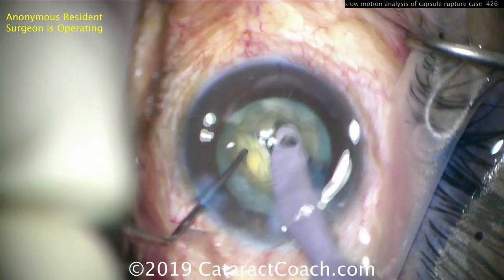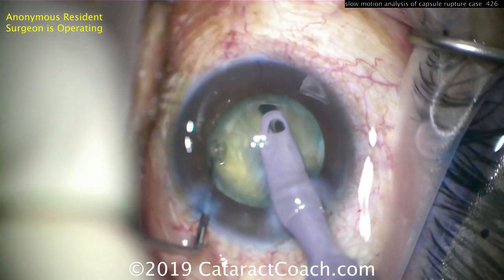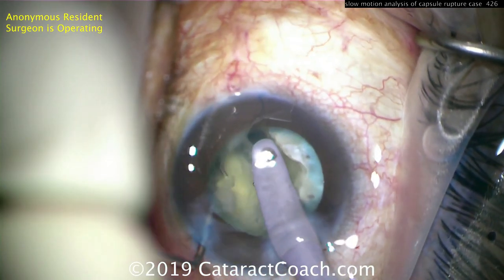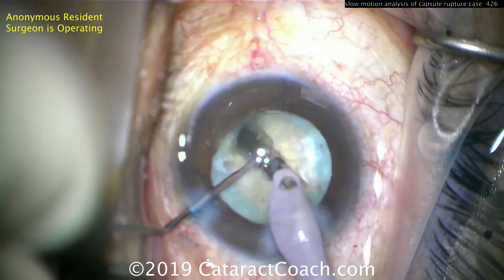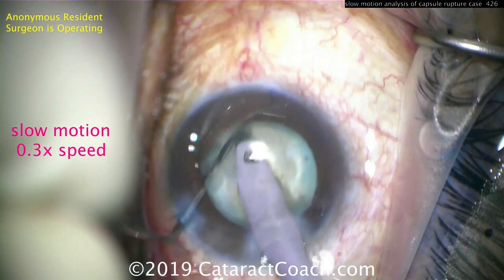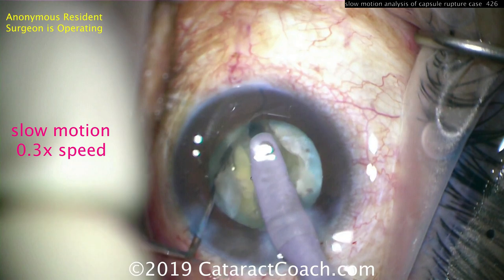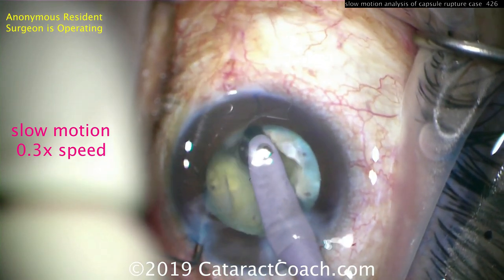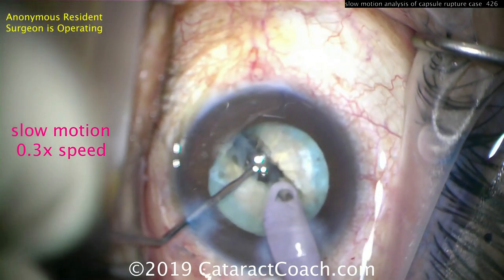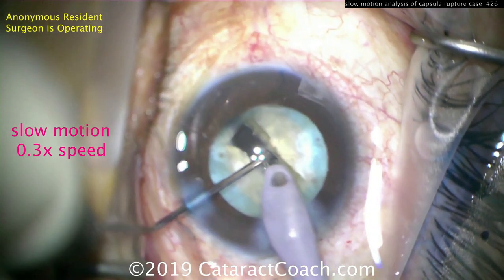Now let's move on to splitting of the nucleus. Here's the first part of the split — that's okay — but when I split again in the area where the puncture was, look what happens. There'll be a snap sign coming up right about here — pow, it snaps. The capsule is violated; it's already completely ripped in half. In slow motion: here's the tentative split, and when it gives — boom, just like that — the capsule is wide open.